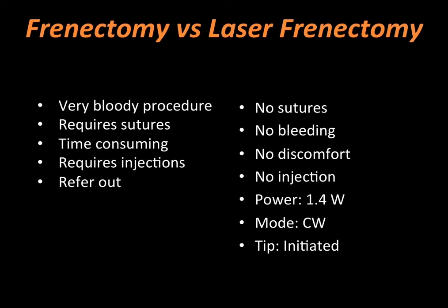As you know, frenectomies, oftentimes everybody has a different technique, but if we use a scalpel, we'll have to put some sutures there. It's time consuming. It's a little scary to the patient. There's a lot of bleeding. We have to numb the area.